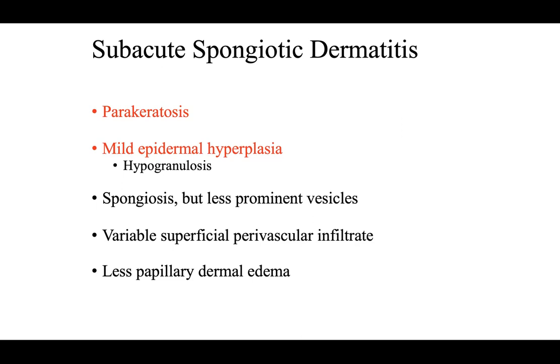So it's really nice to be able to get a biopsy and make sure that, first of all, it is a spongiotic. Second of all, that it's negative for fungus, at least on the biopsy. It's important to have biopsies that contain scale so you can really capture fungal infections if they are present.